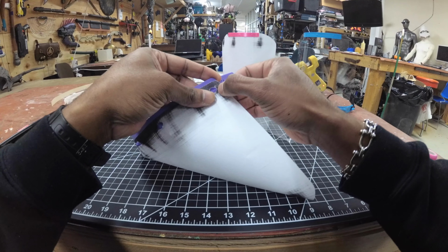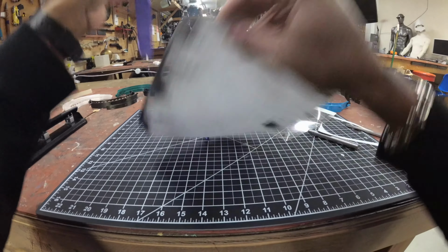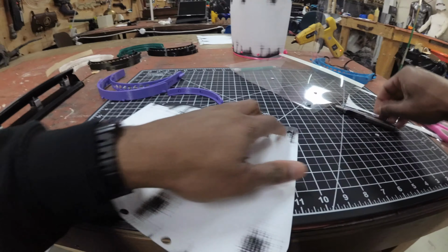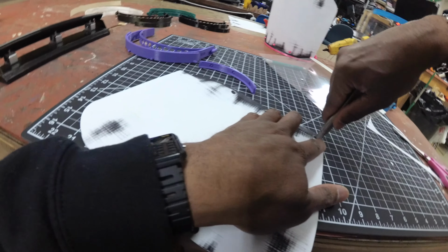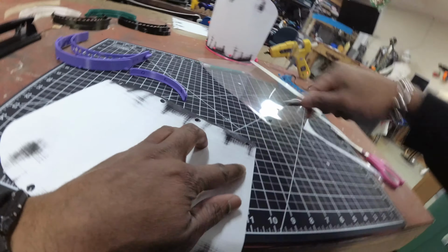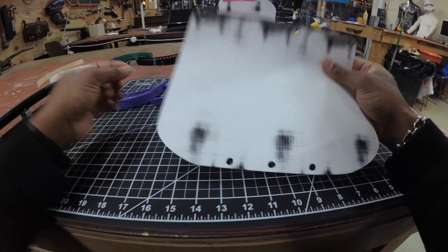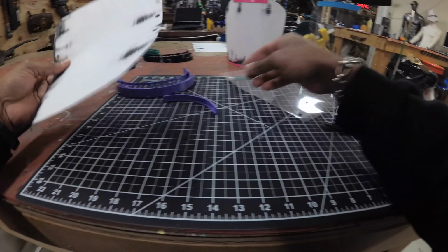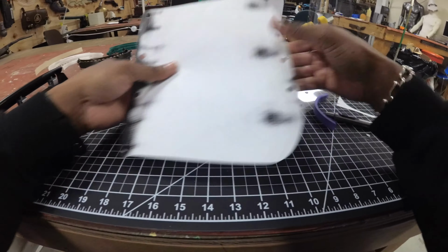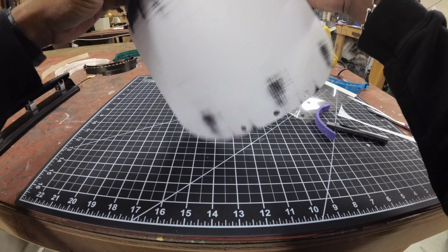And if your paper is starting to tear, then you know that you need to put the hole a little further back, right? Which is what's happening to me right now. The paper is doing a little tearing. So then go back in, adjust the positioning of my hole. That way, when I do it on the actual plastic, I don't have any issues with it. So do test out your dimensions with your paper first before you use your template on your actual plastic sheet.